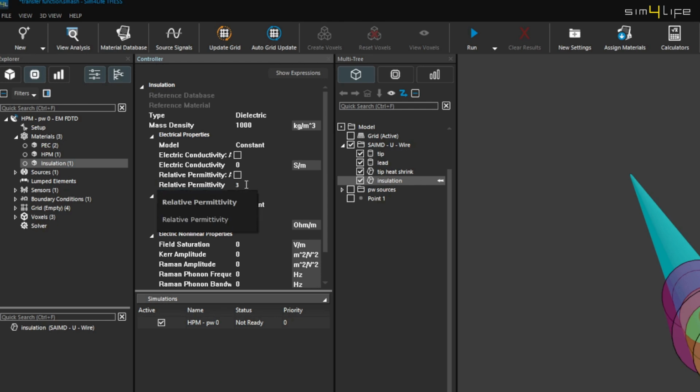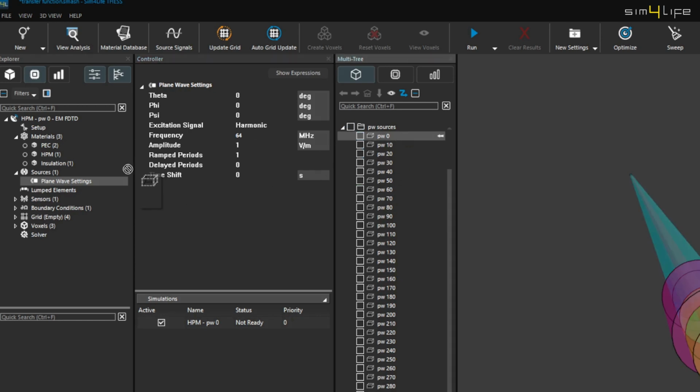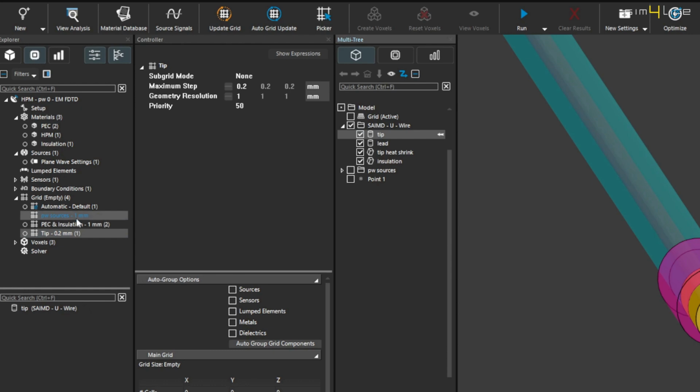According to ISO TS 10974, the background material for the RF heating test should be modeled with a conductivity of 0.47 Siemens per meter and a dielectric constant of 78. We create a new plane wave source setting and set the operating frequency to 64 MHz, starting with the tip source. We create two manual grid settings, one for the lead and the insulation with a maximum grid step of 1 mm, and one more detailed for the tip of the implant with a 0.2 mm maximum grid step.